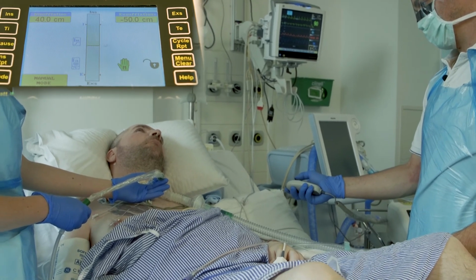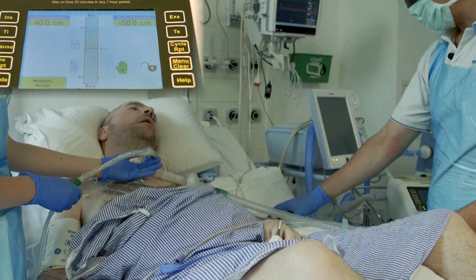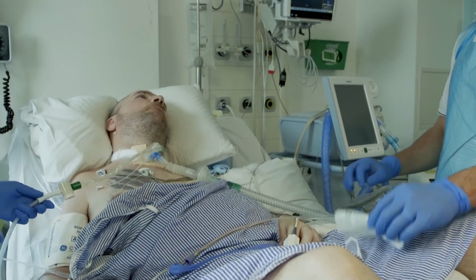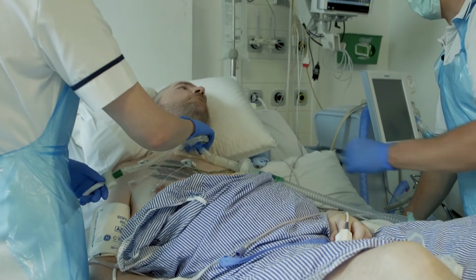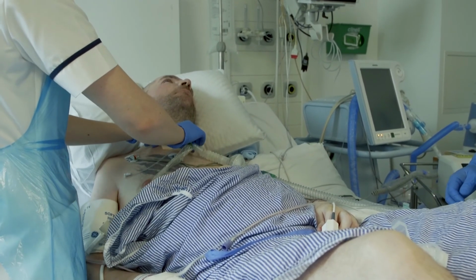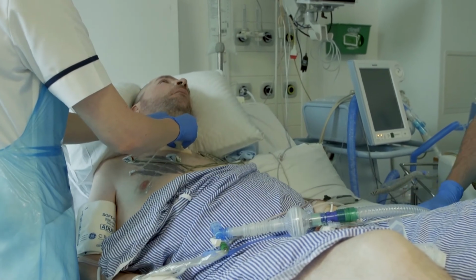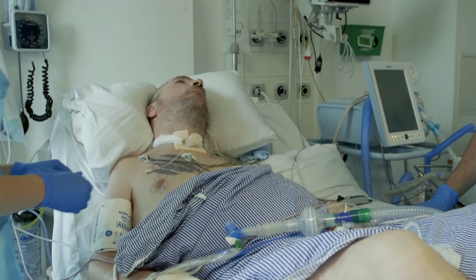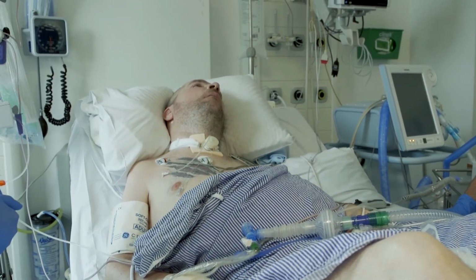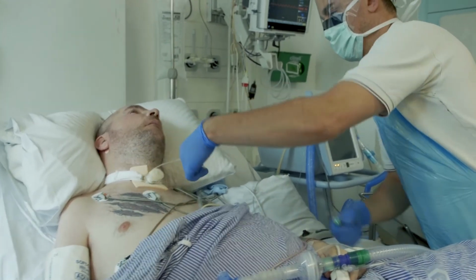The evidence would suggest that peak cough flow is significantly greater when combined between a maximum insufflation and manually assisted cough compared to when their techniques were studied alone. This was shown by Trebbier et al. 2005. Treatment would continue until the patient fatigues or secretions have been cleared.